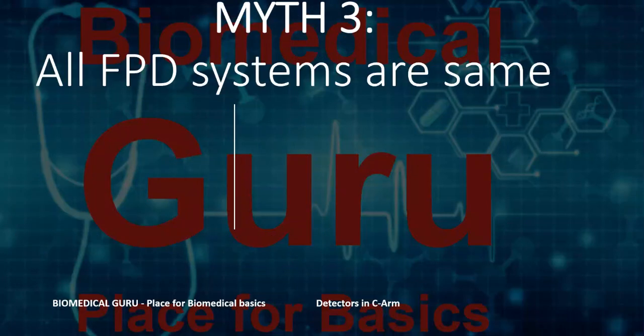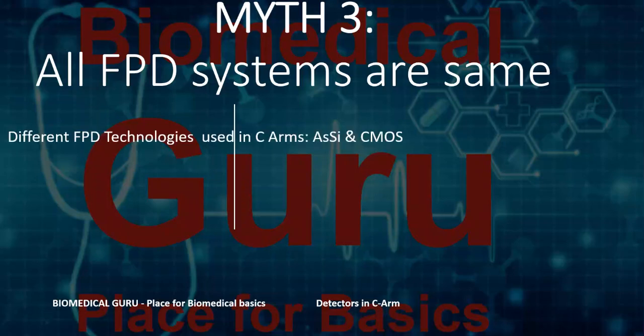And another myth that is commonly prevalent is all flat panel detectors are the same, which is not the case. So in C-arms, especially in surgical C-arms, there are two kinds of flat panels. One is the amorphous silicon flat panel. The other one is a CMOS flat panel. And also it depends on the imaging chain. Some flat panels are designed with just a 1K by 1K imaging chain, which is 1,000 vertical dots and 1,000 horizontal dots that make the image.